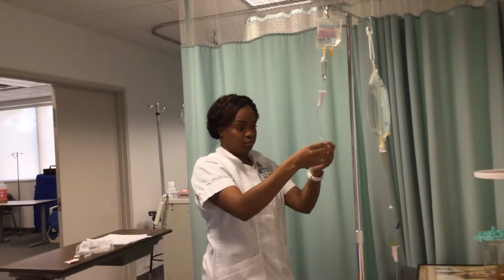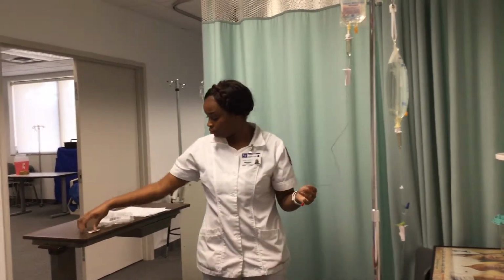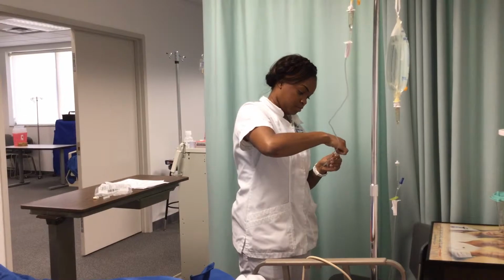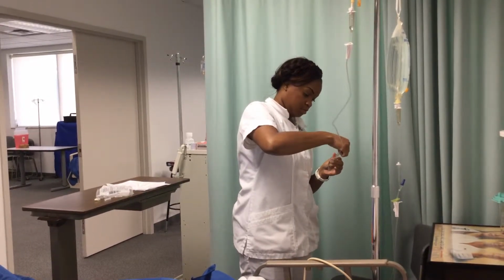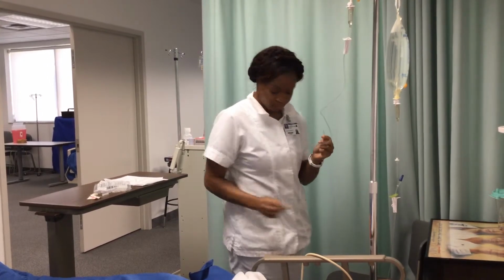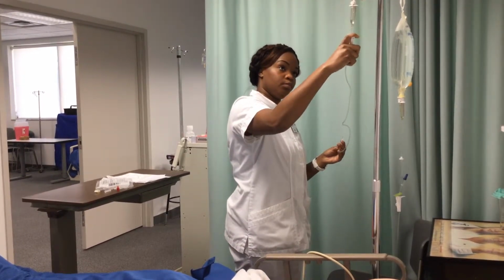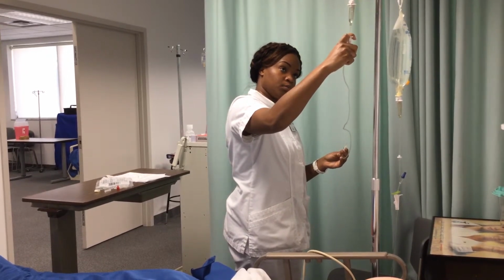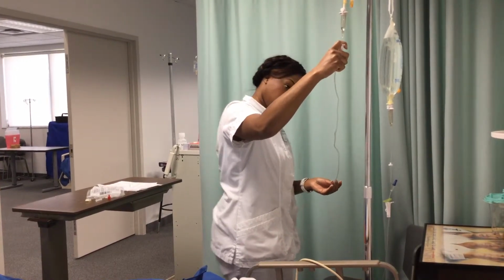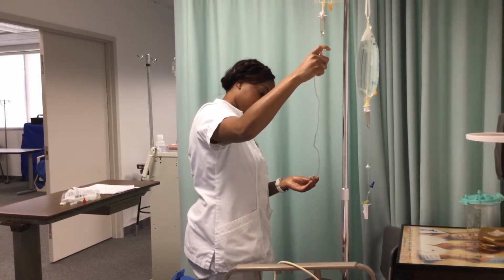Hanging the medication. Before I hook up the medication to the Y site, I'm just going to go ahead and prime it. And the line is primed fully. No air bubbles.